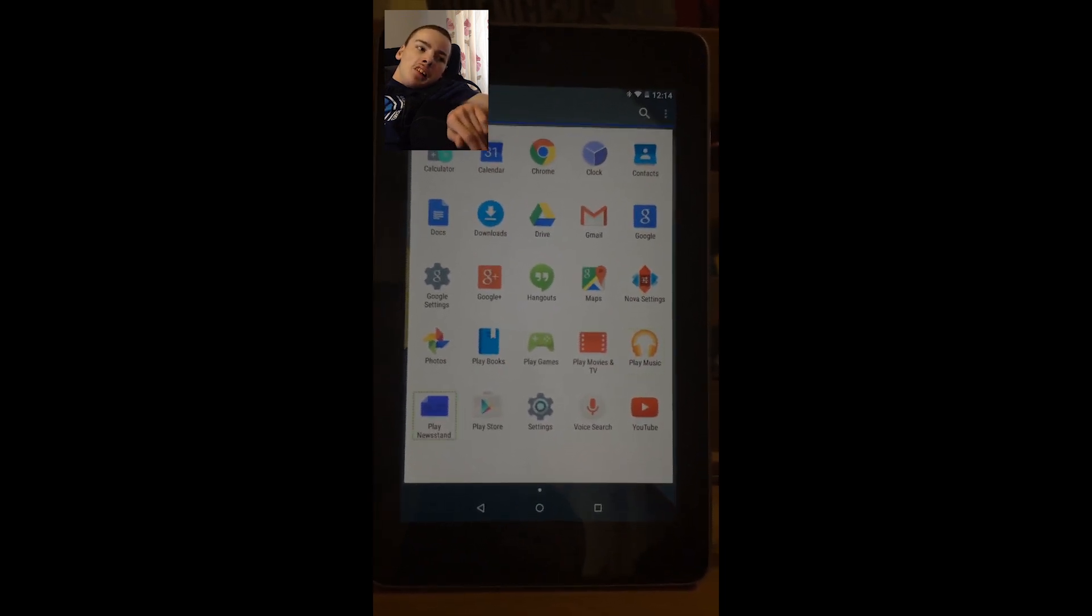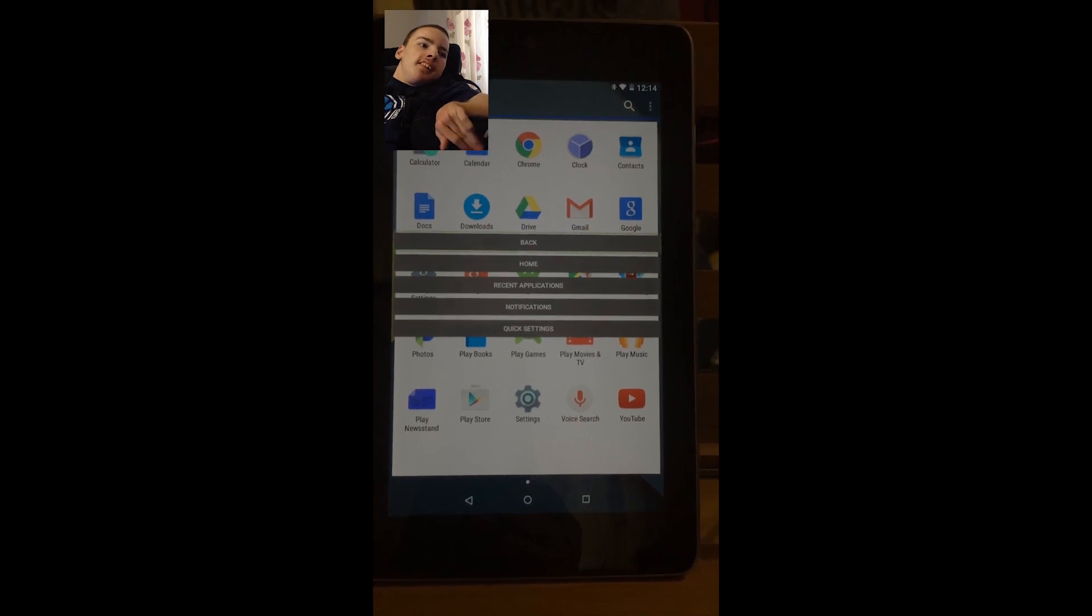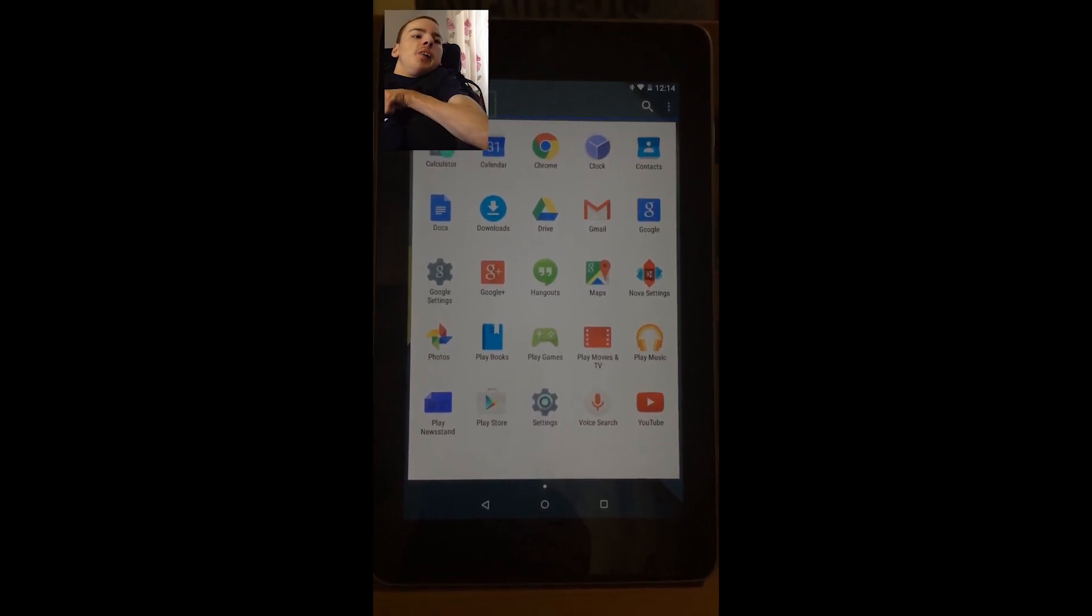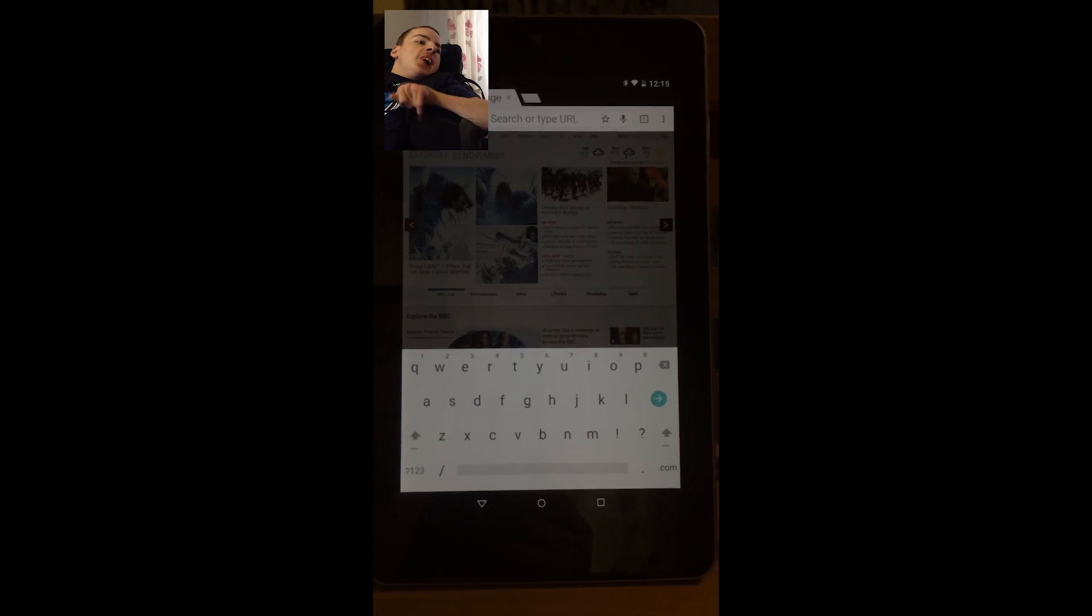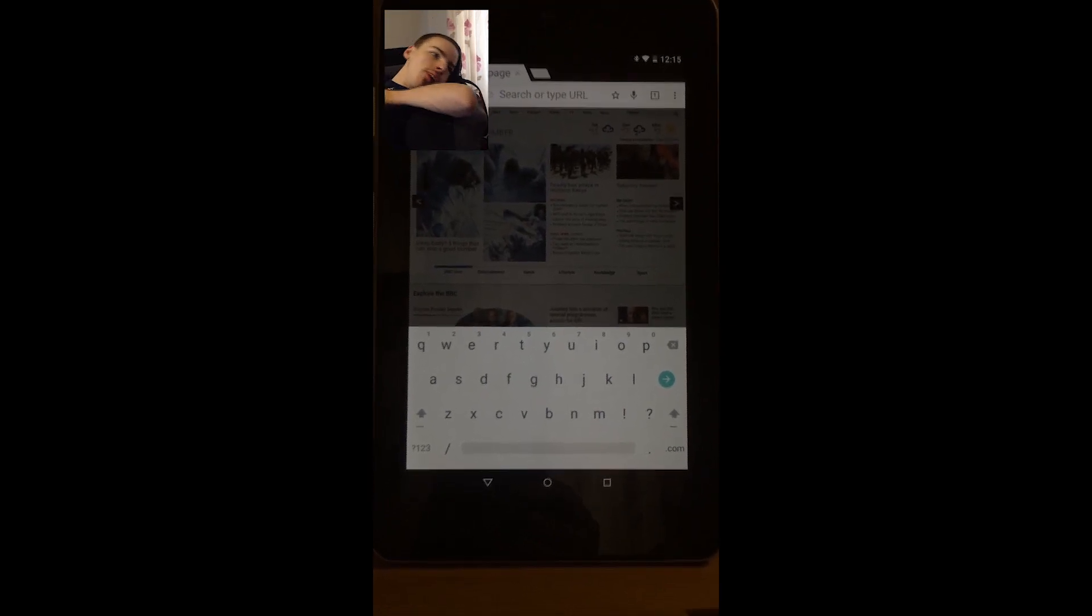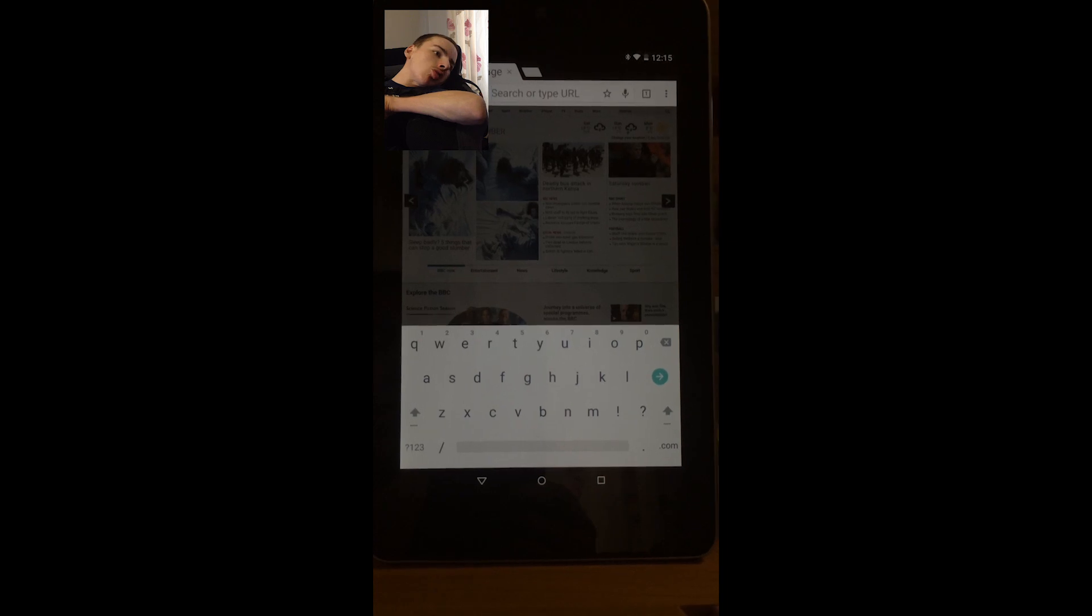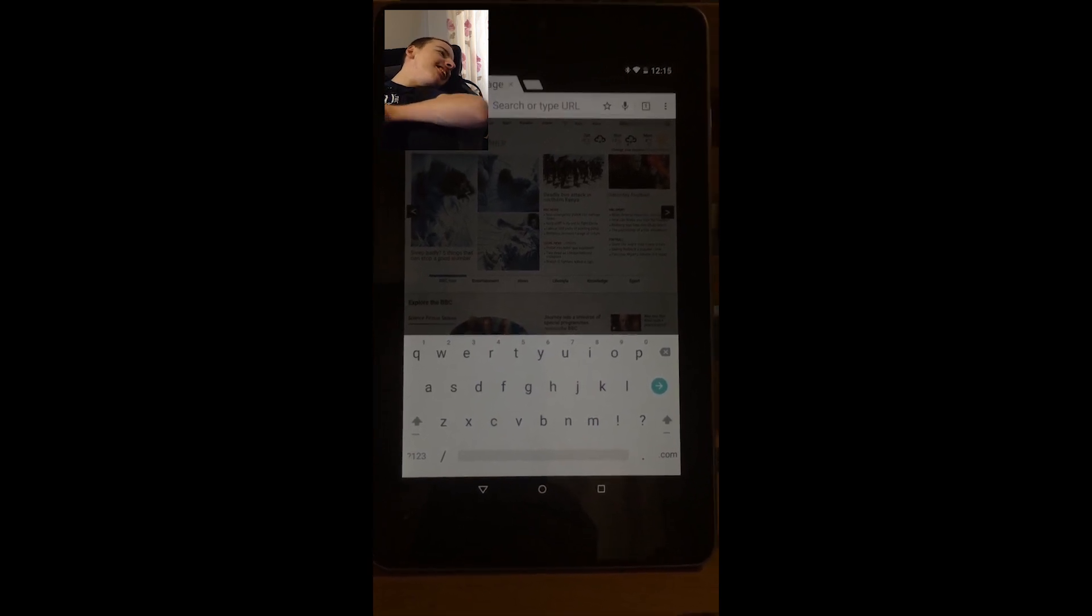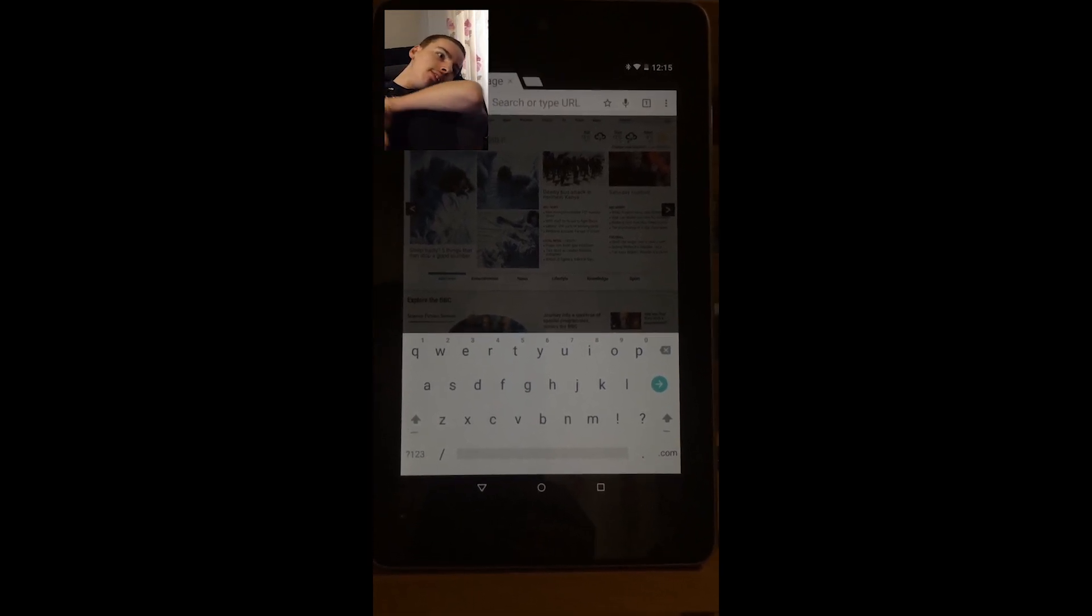Okay. Now one downside, another downside we've found is if we're going to Google, let's try going to Google Colin. We have found, right, we want to go into Google now and we want to type something in, but we don't know. Me and Colin cannot find a way to get switch access to scan the keyboard. Now, we don't know if this can be done and we just don't know what we're doing, or whether this is a downside to switch access. But hopefully that can be improved.